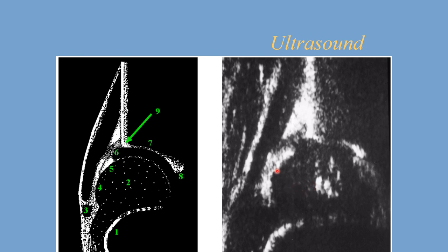A common question is how to be certain a structure is the labrum. There are three features that help: first, the labrum always rests on the femoral head; second, the labrum is always inside the capsule, with a bit of shadow between them; and third, the labrum is always distal to the cartilaginous roof. If all three criteria are met, you can be confident you have identified the labrum.